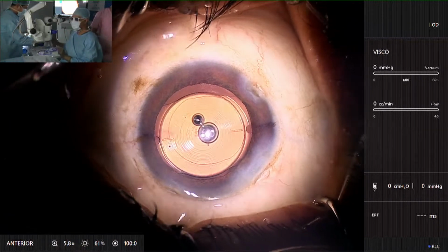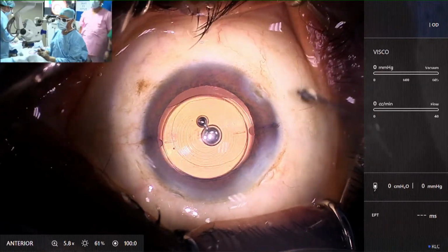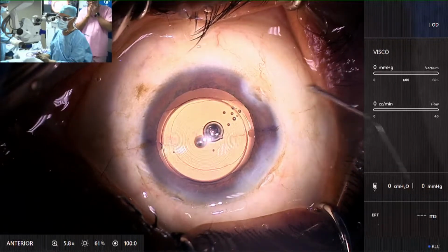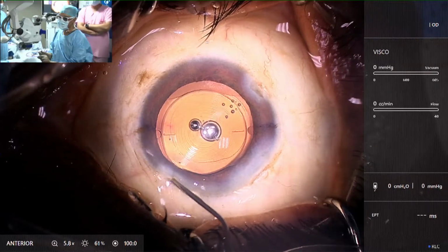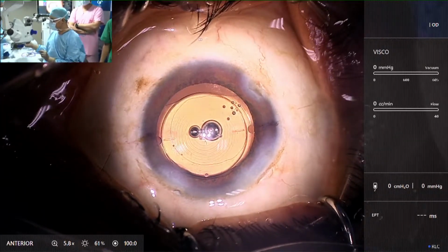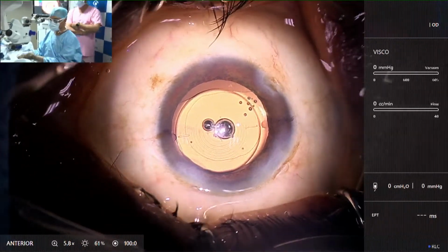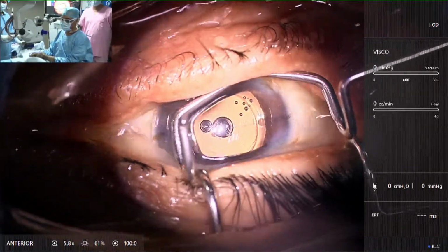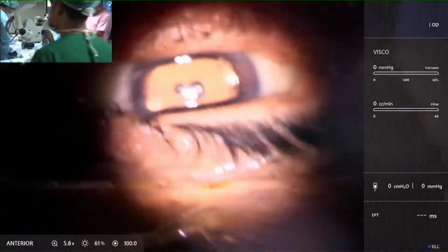One thing I feel very particular about is intracameral moxifloxacin, and I've been requesting everybody operating here today to please use it, especially in a live surgery setting. Whenever there's a high-risk situation, I use it for 100% of my patients. But for those who don't like to use it for 100%, at least use it for those instances. For almost 5 years now, I've been using intracameral moxi. Gaurav, I agree with you. I have also used 100% moxi nowadays after reading this research. There is no harm in injecting, so why should we not use it? Yes, sir.